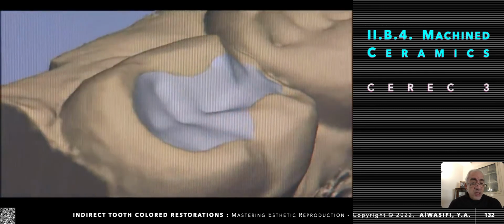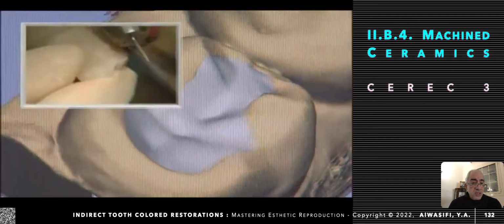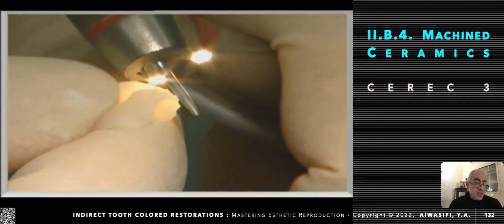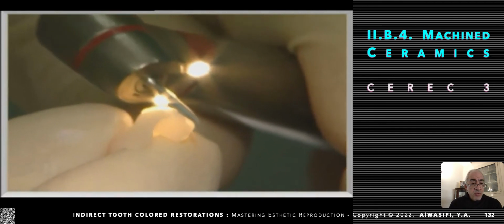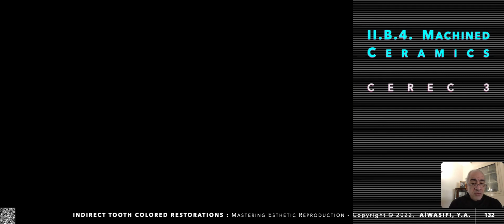By the same way, he is inspecting all the design, okay, and reconstructed it in the same way. He is now, by a special cutting point tip, diamond point, removing the sprue or the handle of the restoration.